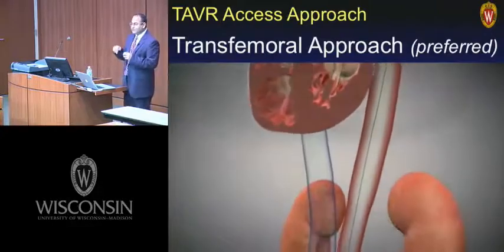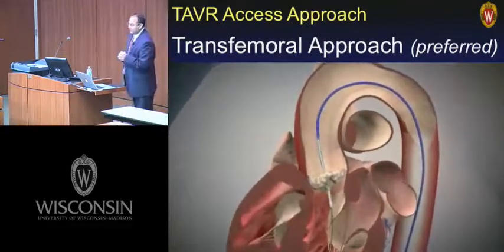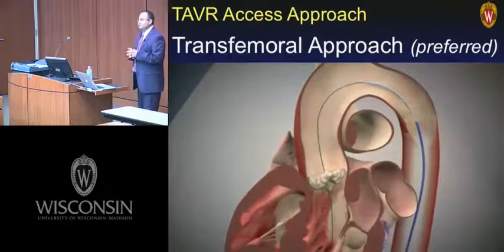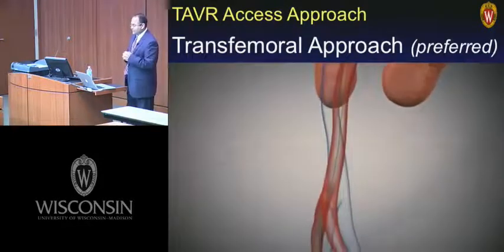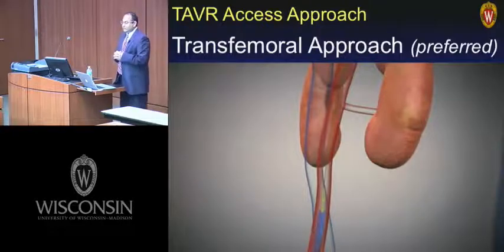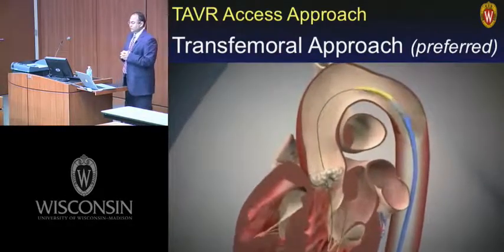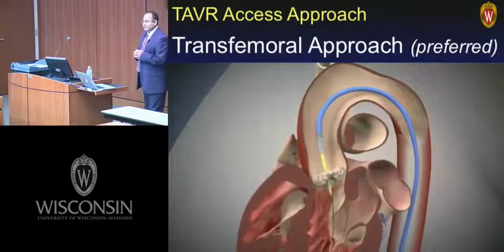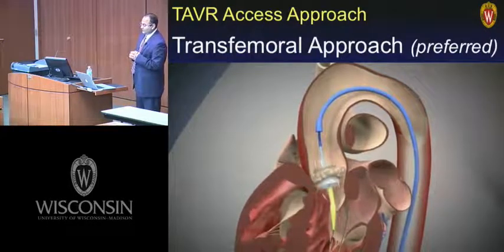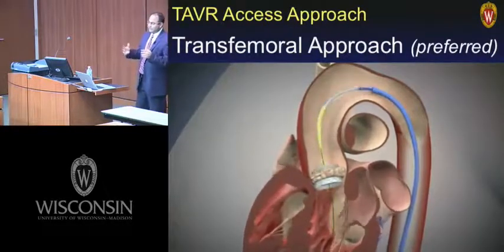It's performed at our institution by percutaneous puncture. The first task is to get a wire across the aortic valve, then over that wire we put in a balloon catheter just to make space for the next device — balloon aortic valvuloplasty. The heart is essentially in standstill due to rapid pacing between 160 and 200 beats per minute to create low pulsatility. Then the Sapien sheath is advanced into the descending aorta, and the Sapien delivery system is advanced over the stiff guide wire into the annulus position. Rapid pacing is again commenced and the valve is deployed. The balloon is deflated and everything comes out.